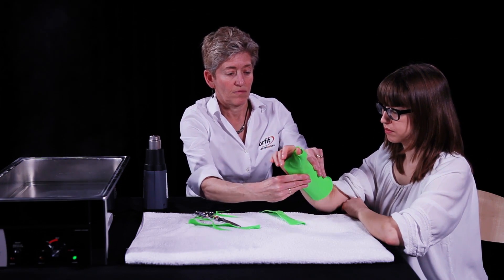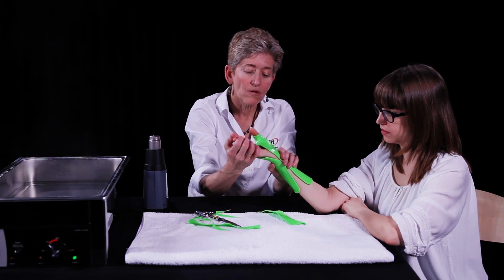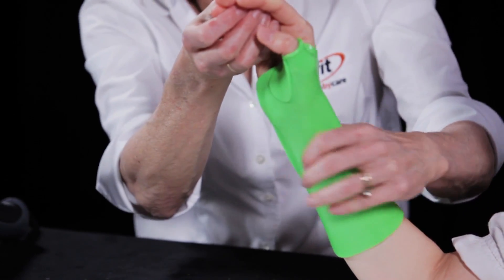Try the orthosis on the patient for fit and make sure the distal palmar crease is free for full finger flexion.